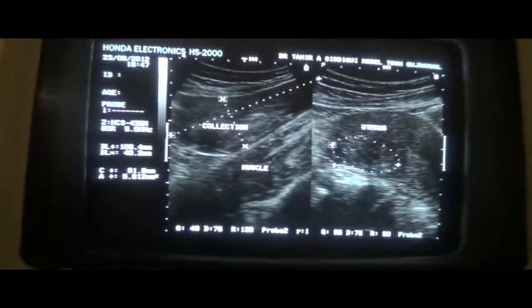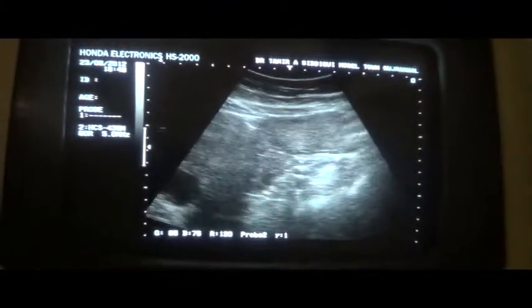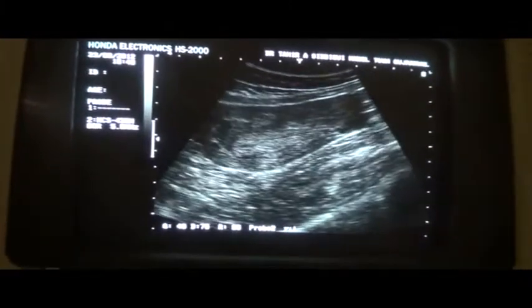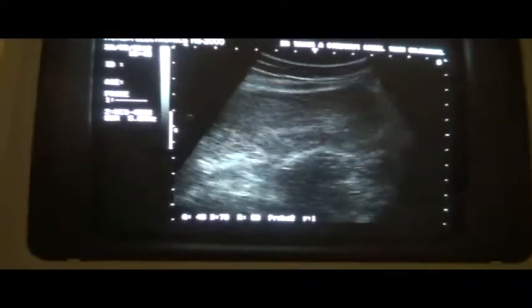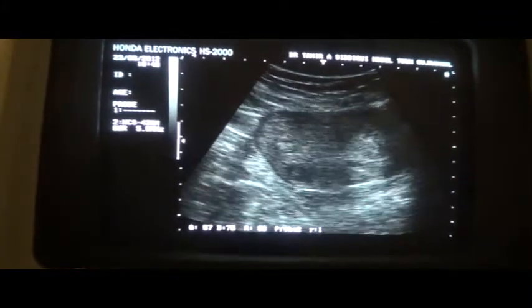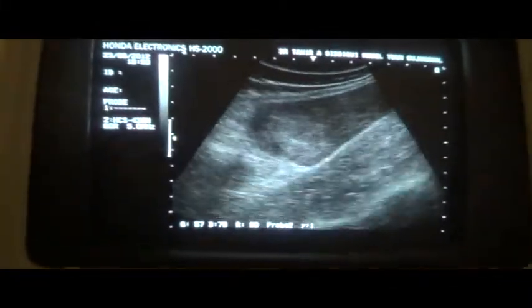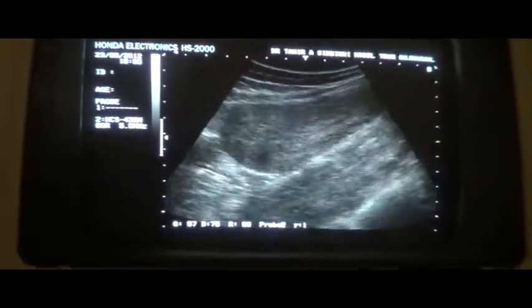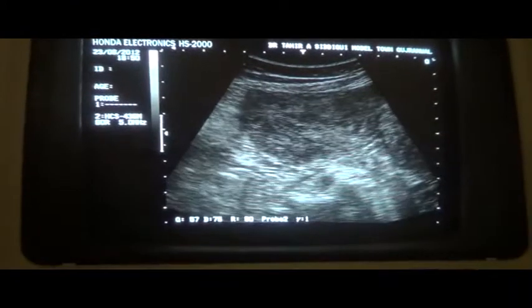There is a little amount of fluid in the cavity. Now I am going to focus on the echogenic area, which is the bleed. Remember that a recent bleed that is being transformed into a clot with the passage of time will appear as you are seeing in the picture now — a very characteristic appearance. You will see layers; these are layers of black blood.